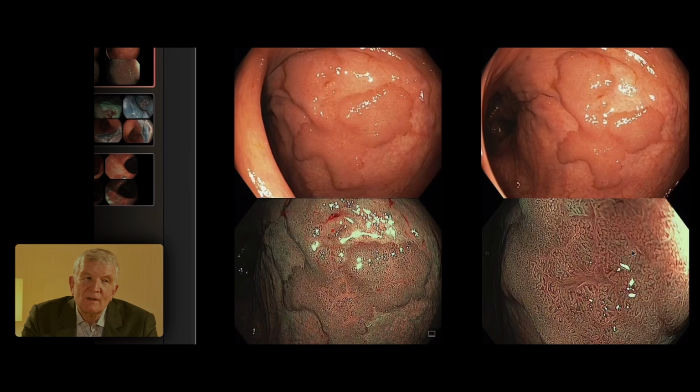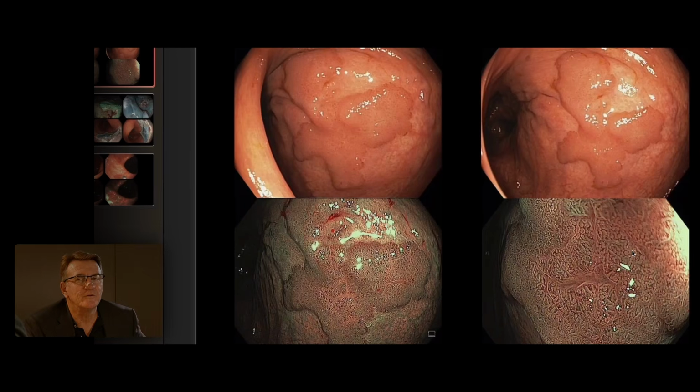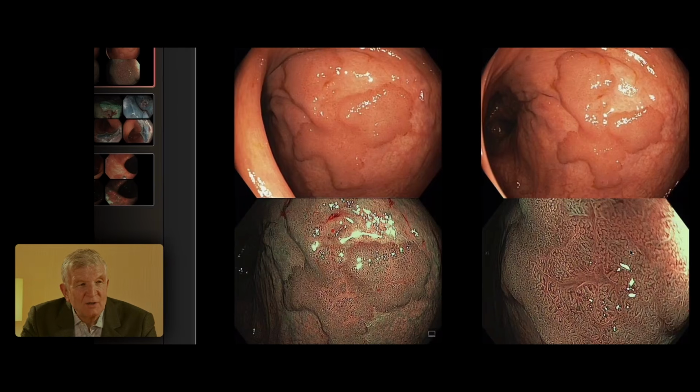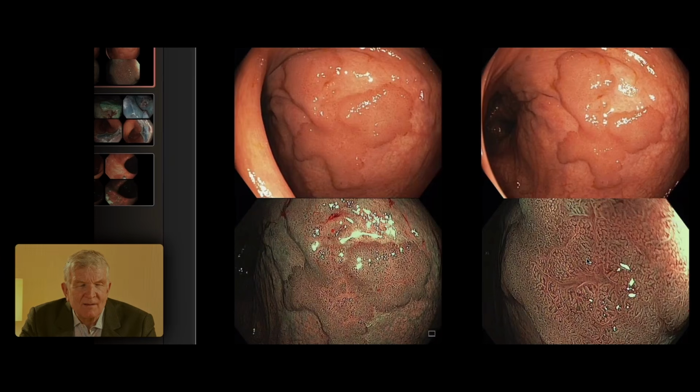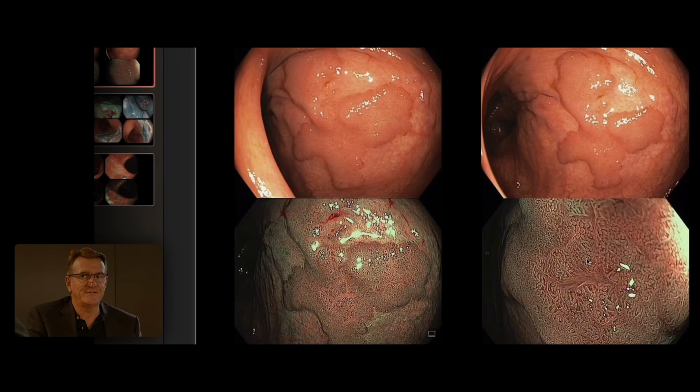And it goes into the EMR box. What do you mean? Sorry? That goes into the EMR box. You do EMR in this lesion? Yes. Oh, yes. It's benign. So there's something which is a little bit... like, so in Asia, 100%, this lesion has never been done by EMR.